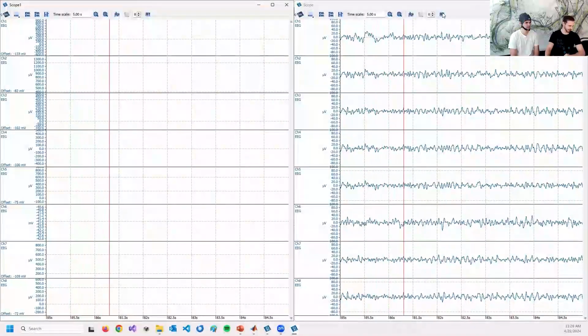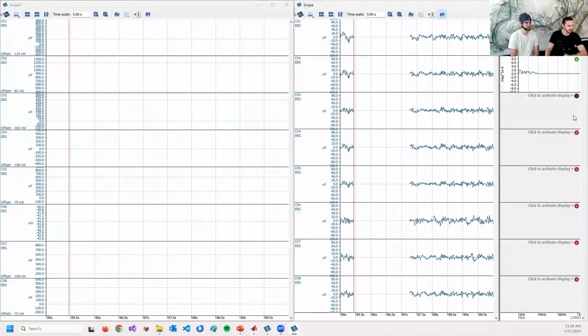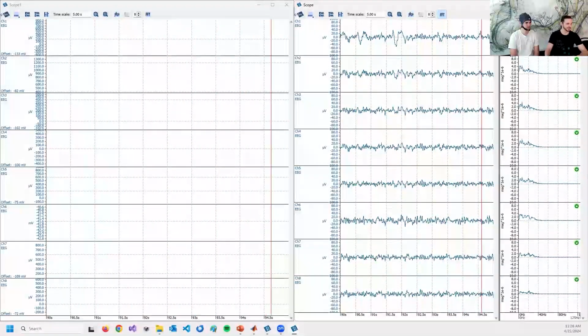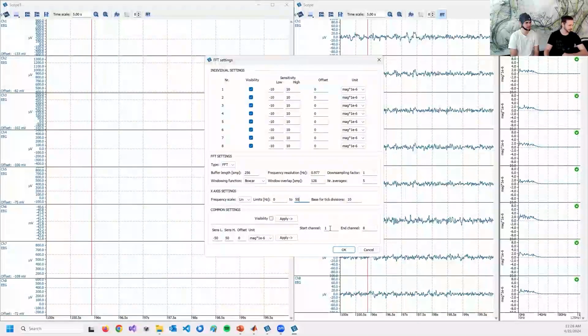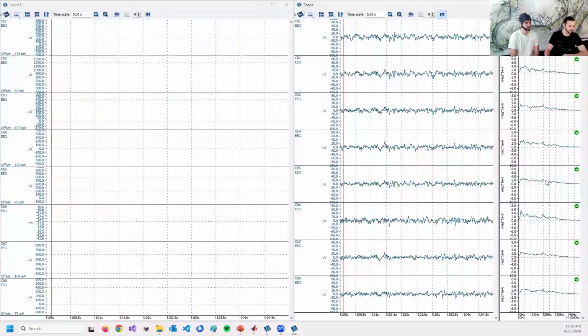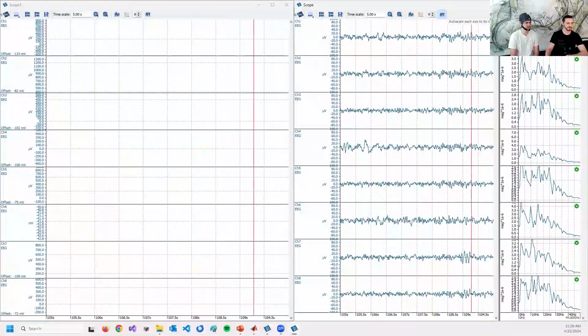So that's good. We can also inspect the frequency spectrum for all the channels that we're acquiring, and maybe just look until frequency range of 50 Hertz. So you can close your eyes again.